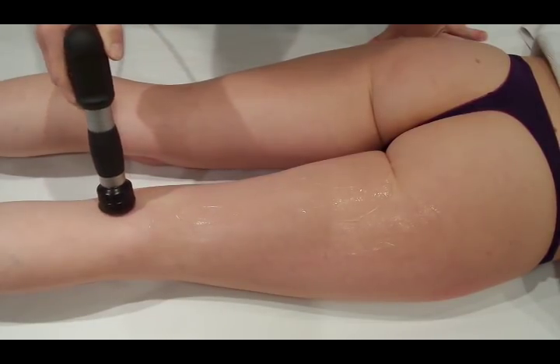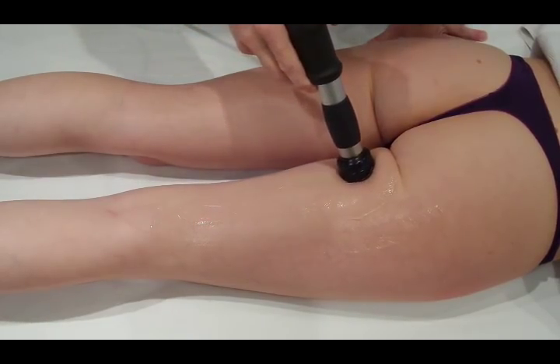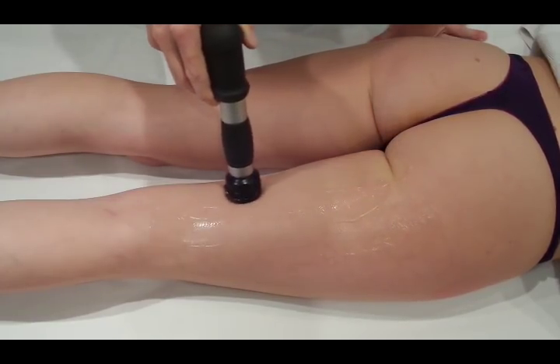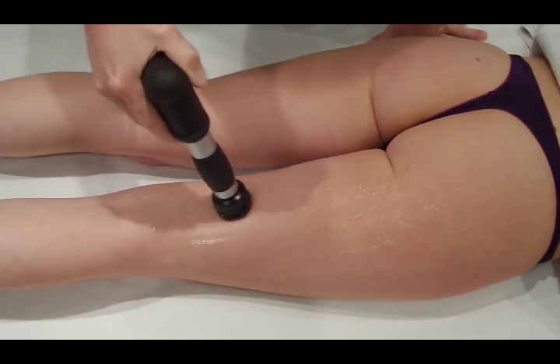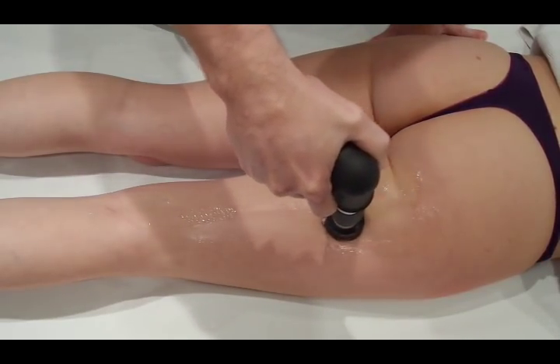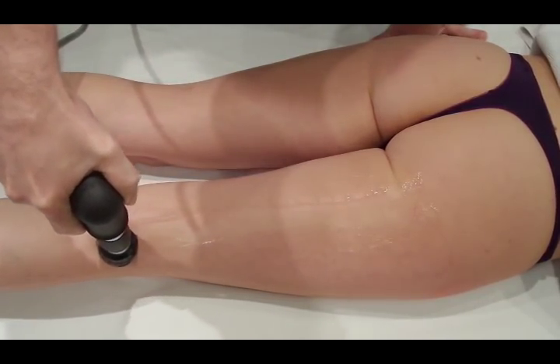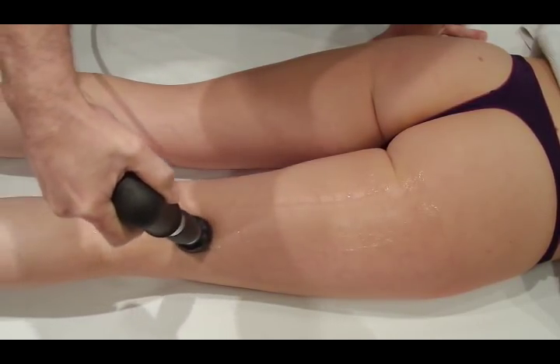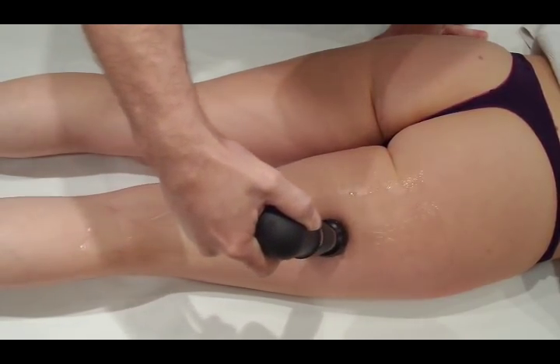We'll start the shockwave on one of the hamstrings — in this case semi-membranosus and semi-tendinosus. We'll move up semi-membranosus and semi-tendinosus to the origin of the hamstrings, doing a little extra push at the ischial tuberosity. We'll work our way laterally until we come out onto the bicep femoris and work down it. We can cover the tendons at the back of the knee as well, and we'll come across the hamstring tendons as well as going across the muscles.